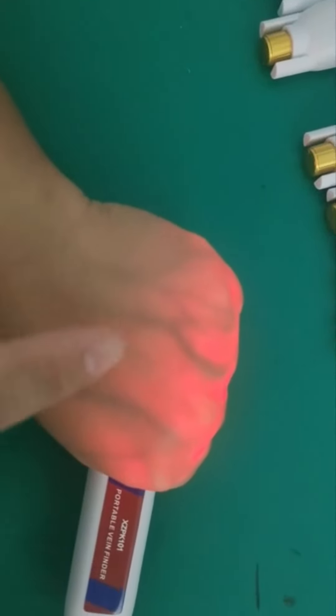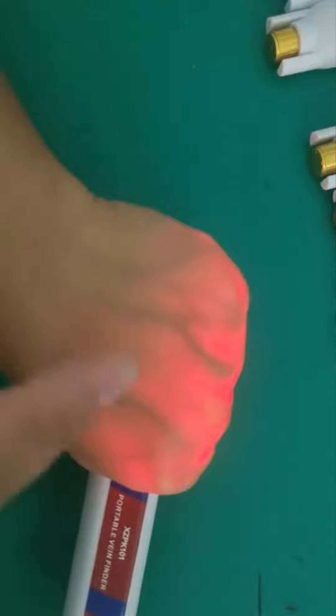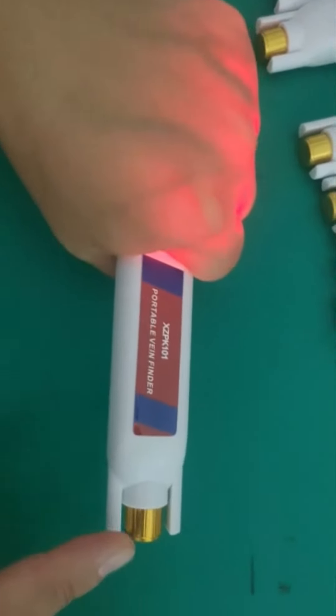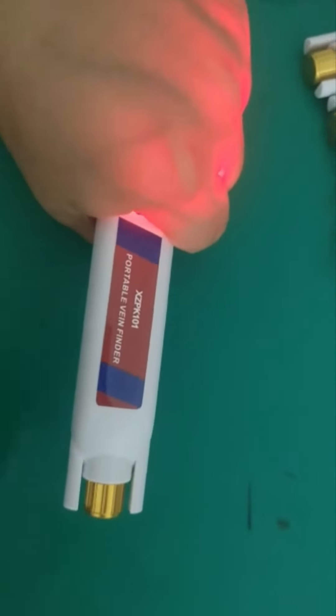Just in this case, you can see the vein locator. So you can puncture or inject. No need to adjust the knob to the meter in this case.